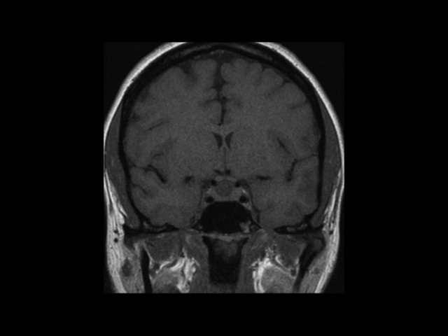This is a 32-year-old female who presented with bitemporal hemianopsia. These images demonstrate a well-circumscribed, round, mildly T1 hypointense mass arising within and expanding the sella turcica.